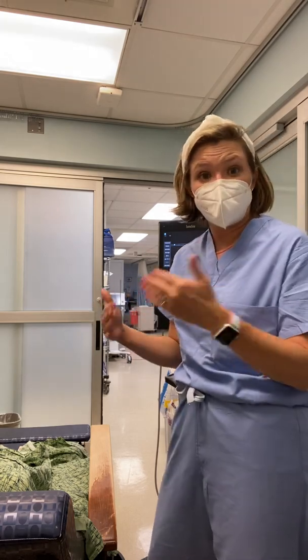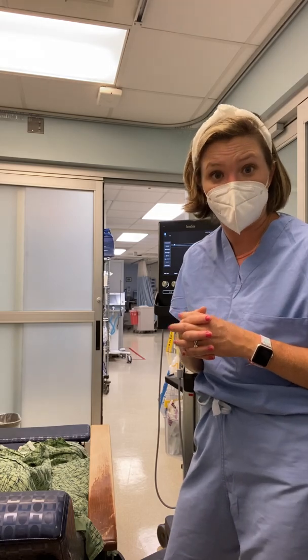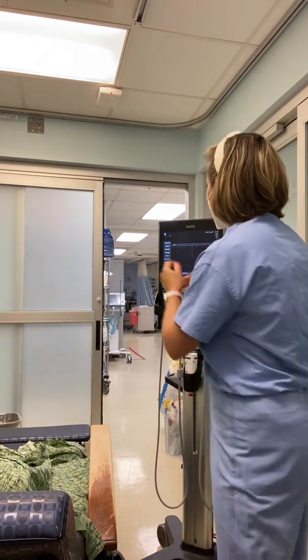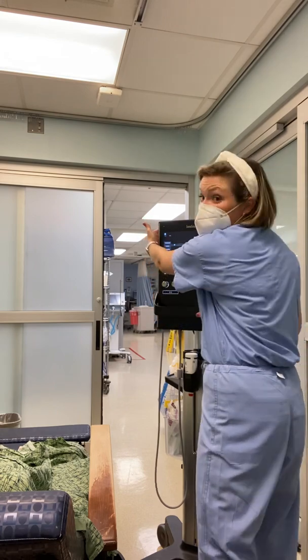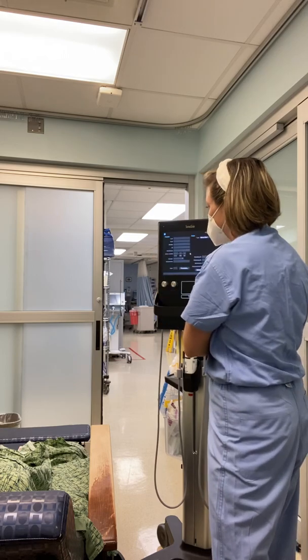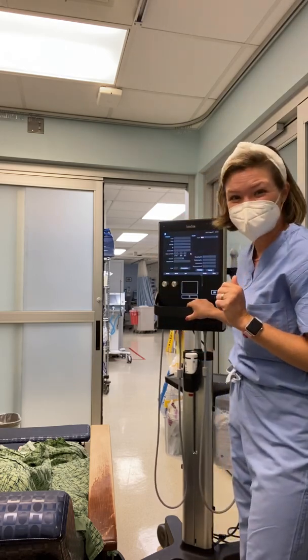So we know that we have a patient coming to the PACU or the ICU for the block procedure. We need to find the patient in the ultrasound machine. The steps for that are to turn the machine on. The button is on the back of the machine. Select patient and information. You'll then wait for the screen to load. Sometimes it takes a while.